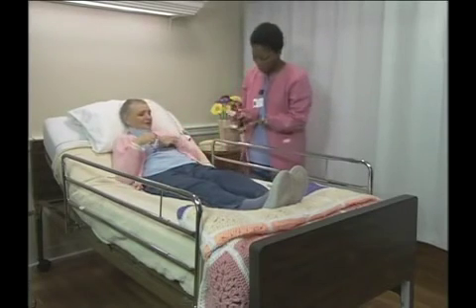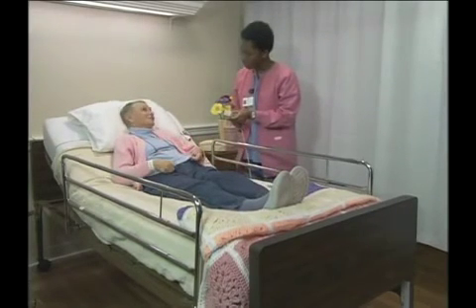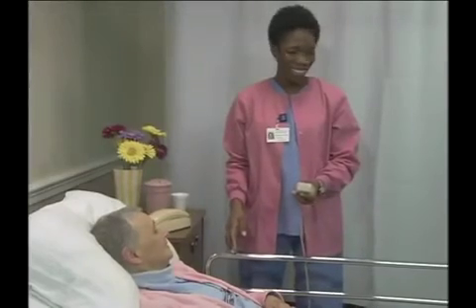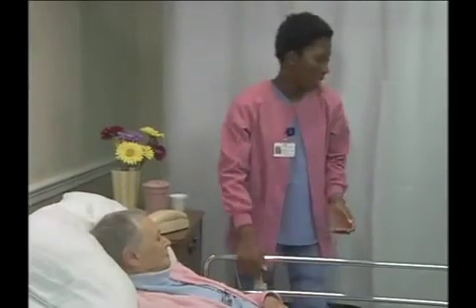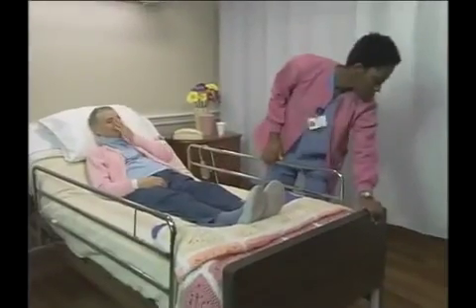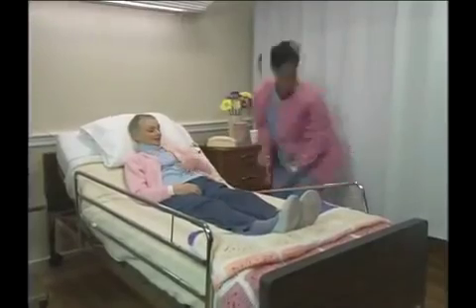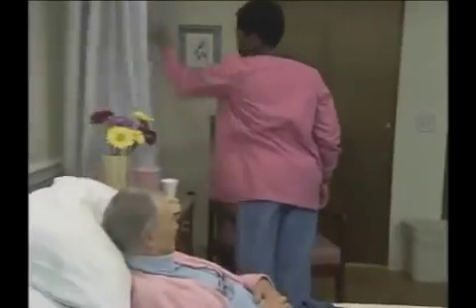Next, see to safety. If appropriate, return the bed to its lowest position. Then, make sure the wheels are locked for safety, and place the side rails in ordered or requested positions. If desired, open the curtain or door and ask whether the person would like for visitors to return.